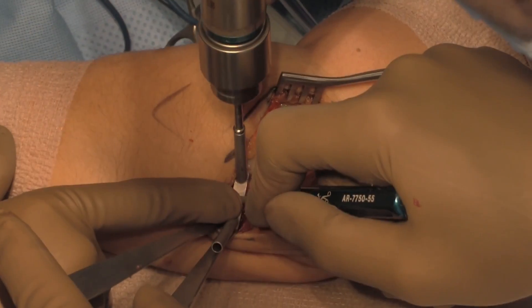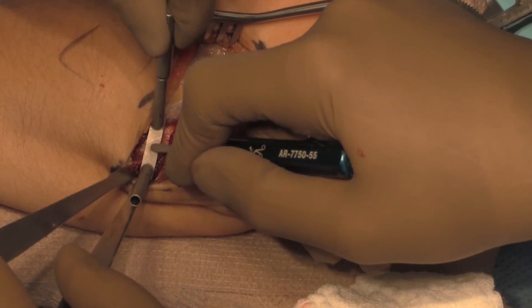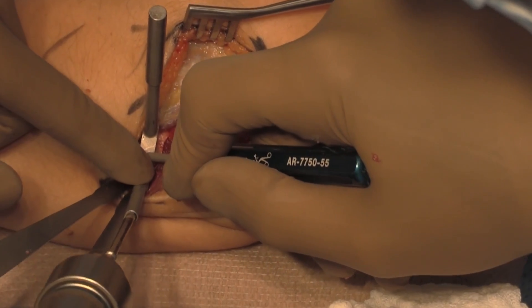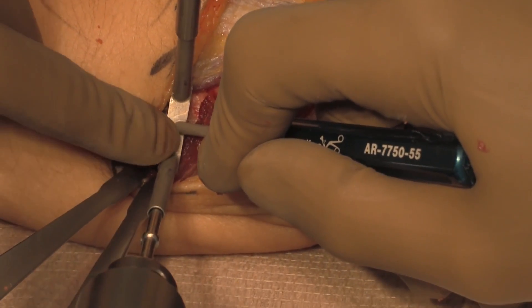The converging guide for drilling the tunnels on the supinator cristae, where the lateral ulnar collateral ligament inserts on the ulna, is utilized. This allows 3.5 millimeter drill tunnels to be drilled into the ulna.